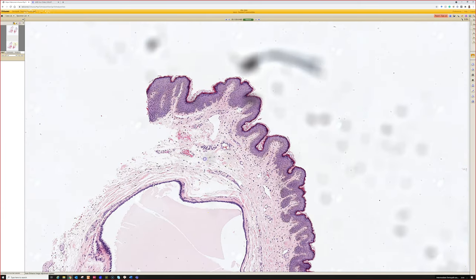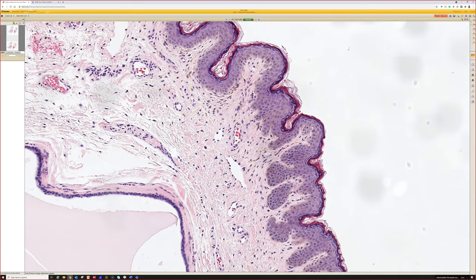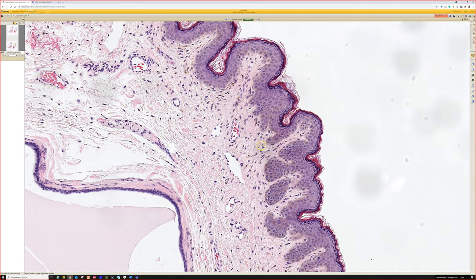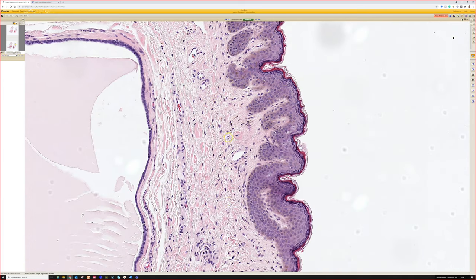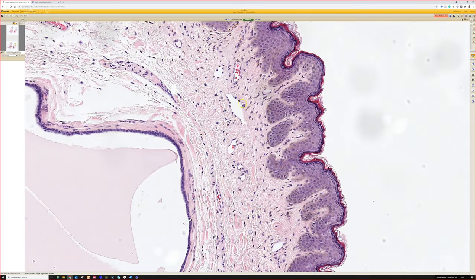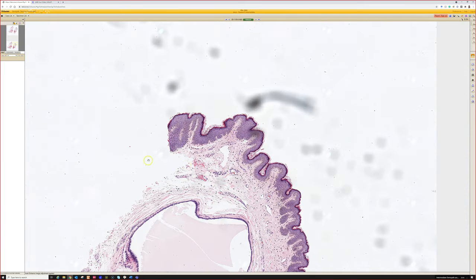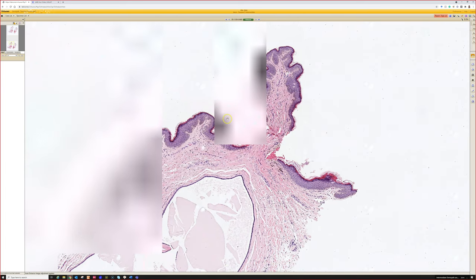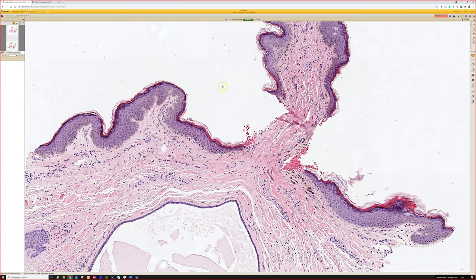And while we're here in the eyelid, let me point out that eyelid skin has a unique appearance. I feel like it often has pigment incontinence. I don't know exactly why. Maybe someone's published that and I just haven't seen that paper. But I noticed that a lot. It has a very loose, edematous dermis. It's very pale. It tends to have pigment dropout. I kind of wonder if that has something to do with the dark circles that people get under their eyes sometimes. That's totally a theory that I have not in any way investigated, but it's made me wonder because I see it so often.